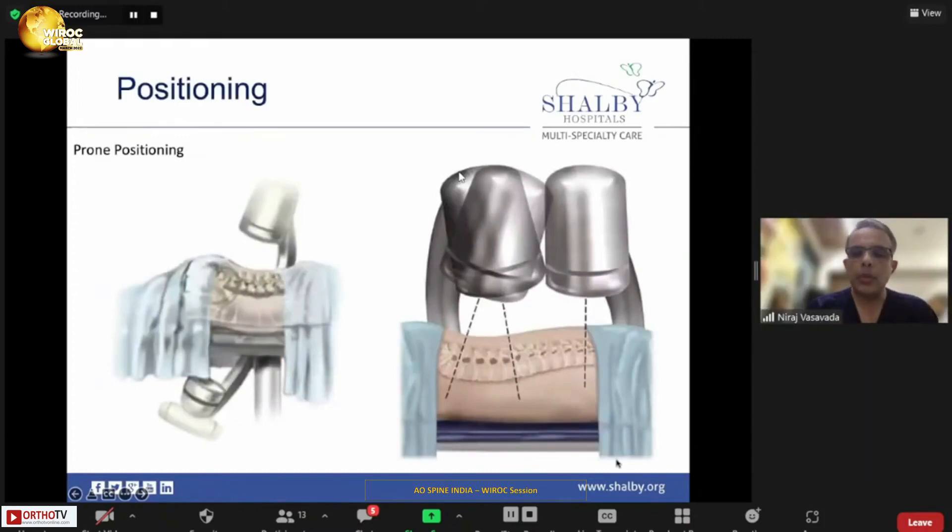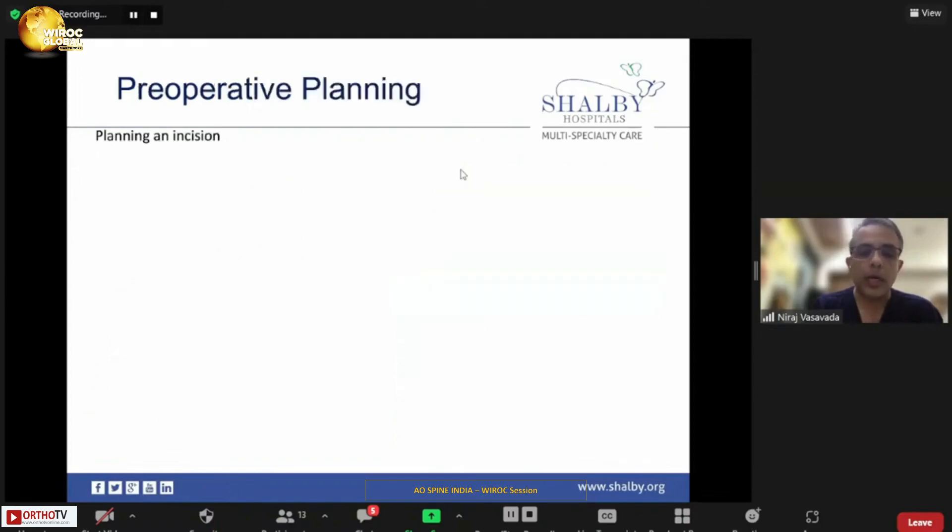We start any surgery with proper positioning. We have to do preoperative planning, and it is not different when putting percutaneous screws. Position your patient so that your C-arm has a clear preview, because sometimes the table mount would come in your way. Specifically, if you are doing a lumbar L5-S1 and want to use a Ferguson or tilted view, this kind of table might be a problem. Make sure you can visualize all levels clearly before draping your patient so that you can adjust.